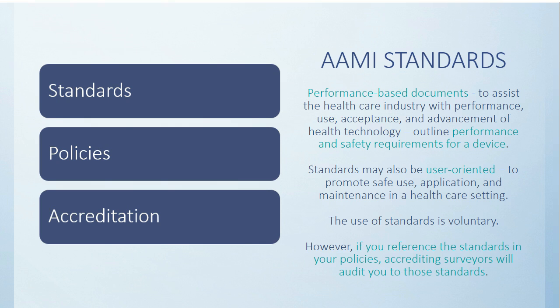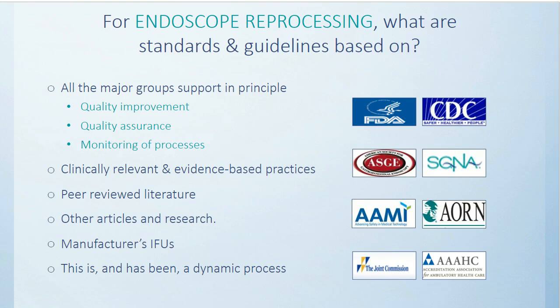Next slide. For the organizations and documents that direct processing of reusable medical devices, these are the common foundational threads. This continues to be a work in progress. The good news is that little by little, the major organizations that produce the standards and guidelines are coming together on key content, especially related to, as you see, quality control and evidence-based practice recommendations.